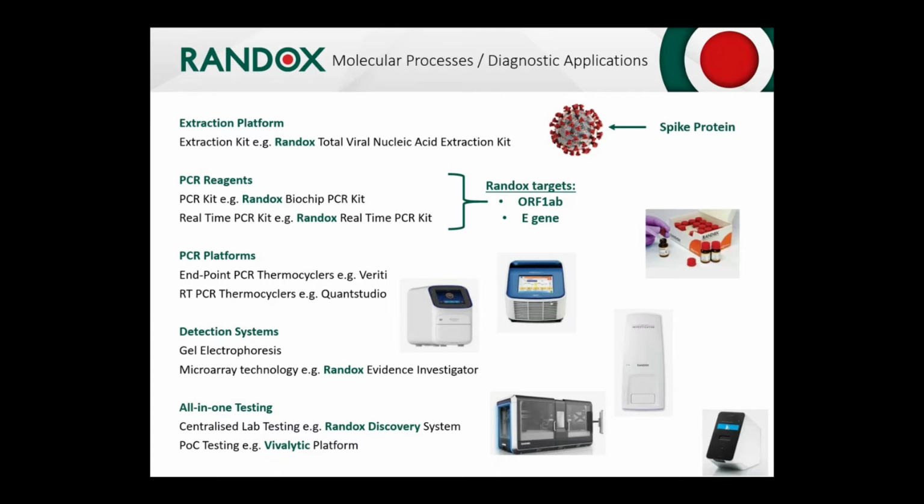Yes, well, back in February, March time, just after the viral genome of the coronavirus was made public by the Chinese government, multiple diagnostic companies such as ourselves went straight online to look at the viral genome. Let's look at the genetic makeup of the virus to see exactly what the genetic sequence is, and let's look at designing little chemical tags called primers and probes to see how we can accurately detect this virus in human samples, such as nasopharyngeal swabs.